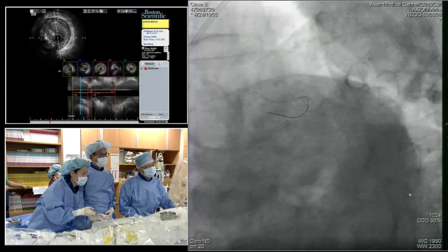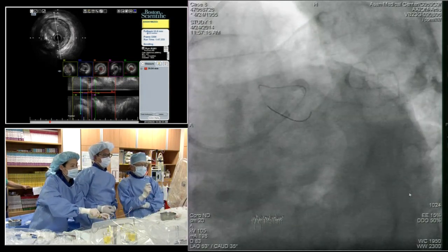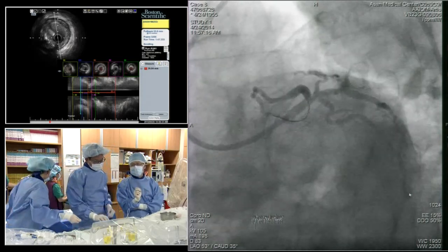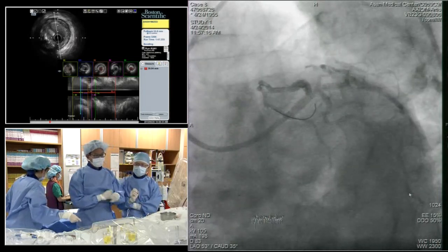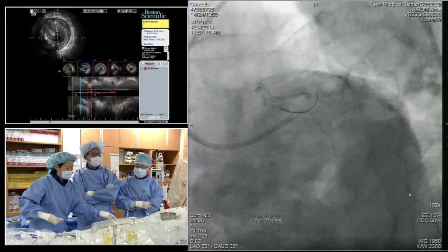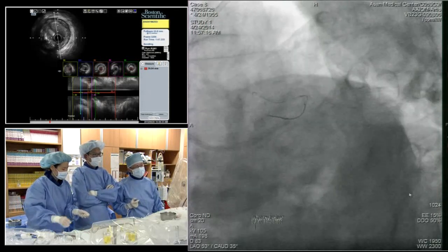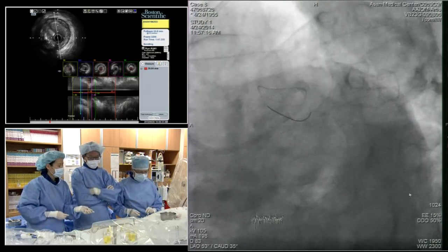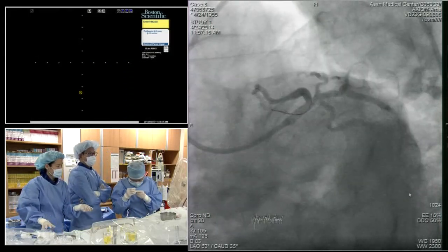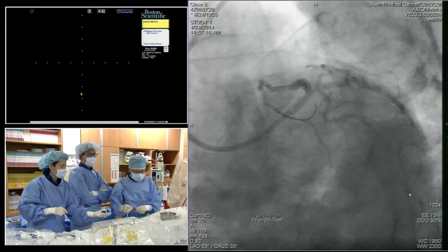Yeah. And also the good news is that the trifurcation looks pretty good. There's no anatomical shift to it. From the angio, it really looks quite good, but I think doing an IVUS in these left main bifurcations gives you a lot of reassurance that you don't have to worry about it. Even when you sometimes see a little white line because of the strut covering the circ, you will still be happy with it. So I think the pre-check with this position is a very helpful thing. So I'm going to put an IVUS in just to take a look at it in case we run out of time, and then we can see how this looks without pre-dilatation.